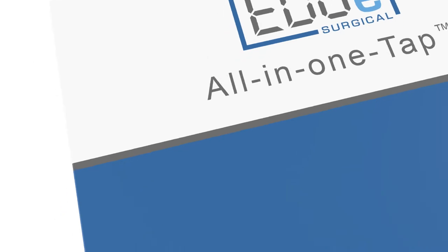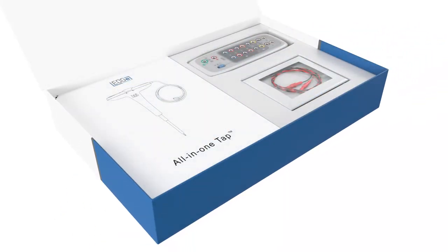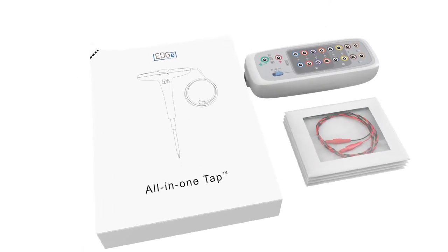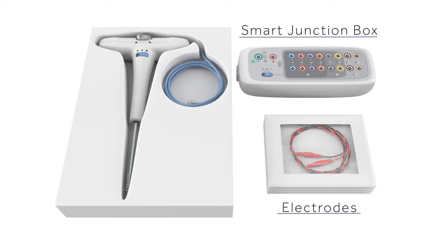Edge Surgical has developed the first and only single-use spine all-in-one tap. The all-in-one tap is packaged in a single-use box containing the muscle electrodes, a smart junction box, and the all-in-one tap handpiece.